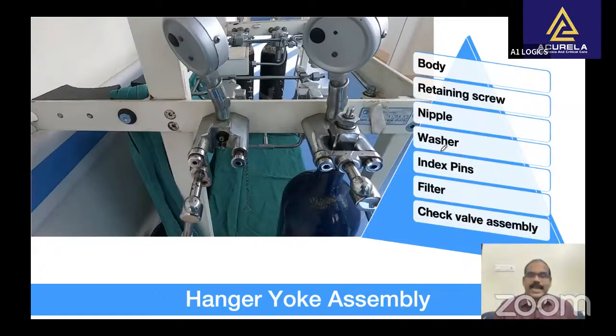The workstation standard requires that there be at least one yoke for oxygen and nitrous oxide. If the machine is likely to be used in locations that do not have pipeline gases, it is advisable to have a double yoke, especially for oxygen.